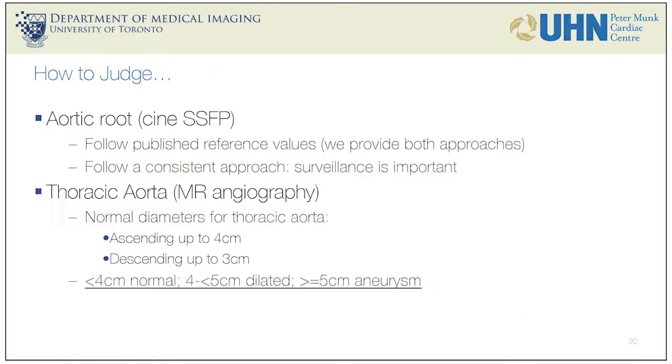And there's no data that's based on CT or MR angiography data. Most data is based on cine imaging, which is systolic and diastolic, or phase contrast. There's a huge lack of data out there. And in terms of recommendations, root is actually relatively easy. There's clear data.